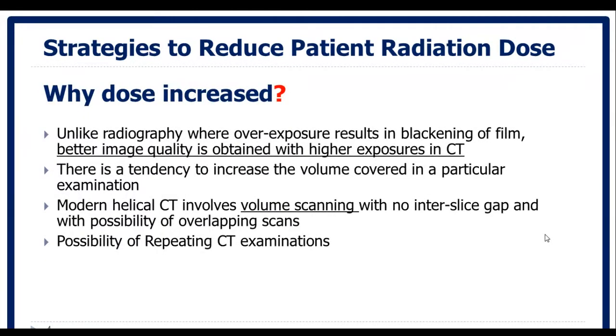Why does dose increase? In continuation to what Prof. Abdulmunem mentioned, image quality and dose are dependent factors, and generally, especially in digital imaging, an increase in image quality requires an increased dose.